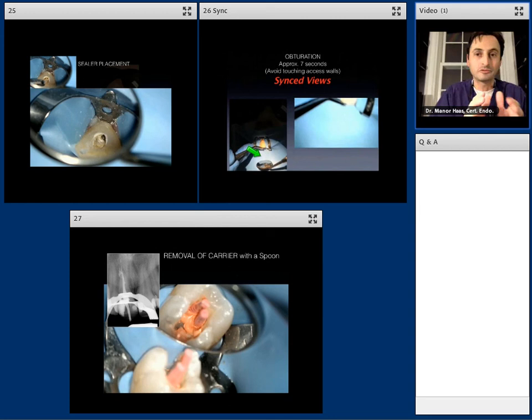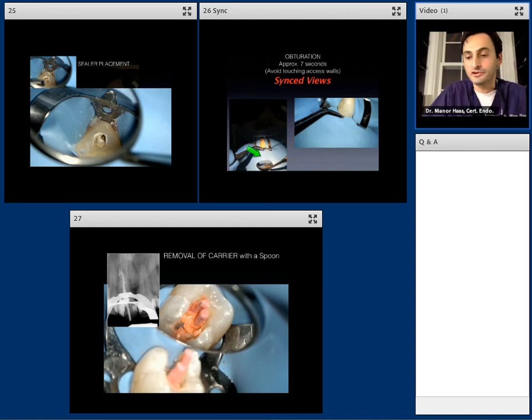And Sergio Kuttler, who's a phenomenal clinician, wonderful endodontist, has this brilliant idea of just saying count elephants, if that makes you count a little bit slower: one elephant, two elephants, three elephants. And when you're first performing this technique, I would even recommend that you have your assistant count with you. Now, your patient might start going, what's going on over here? How come you guys are counting out loud? But really, you do it once, you will remember this.